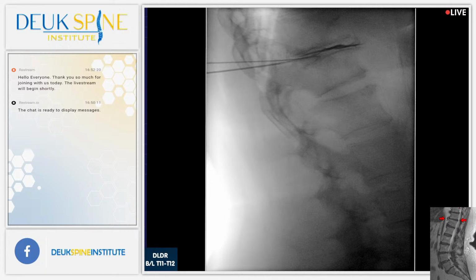All right. So here we go with our dilator. I can use some numbing medicine in this area because we're not too close to the spinal cord. But when you get too close to the spinal cord, you don't want to use numbing medicines. Otherwise, you'll get spinal anesthesia. Right? And I don't want to do anesthesia. That's Dr. Burndes' job. Everything okay? Yeah.